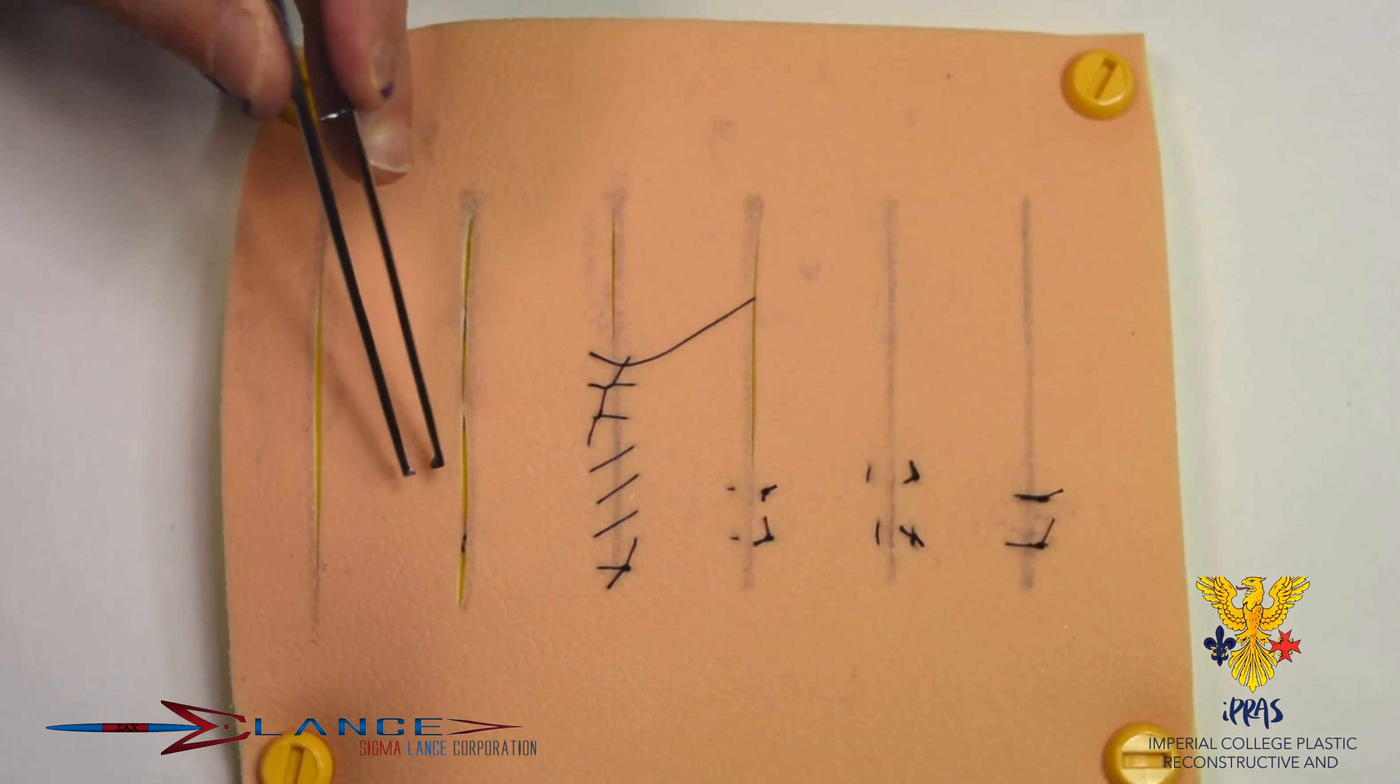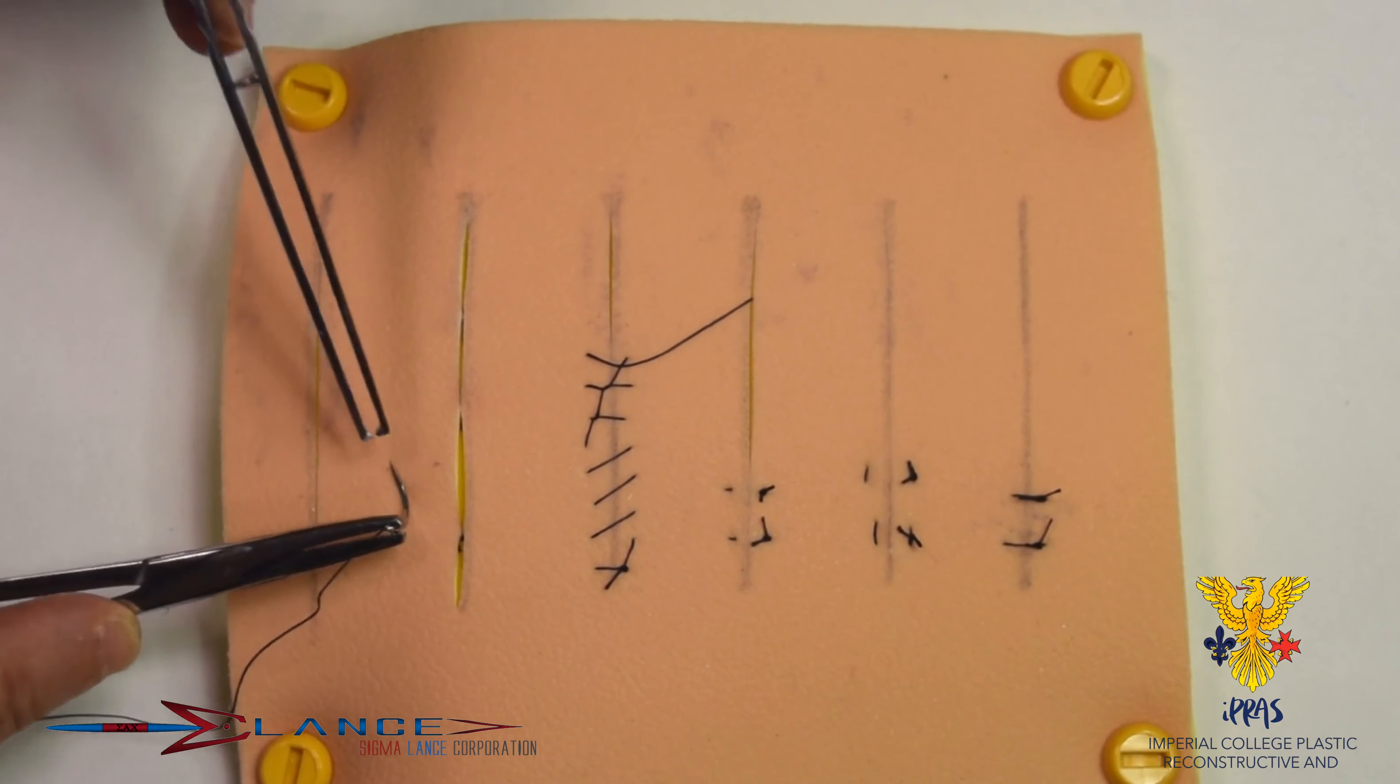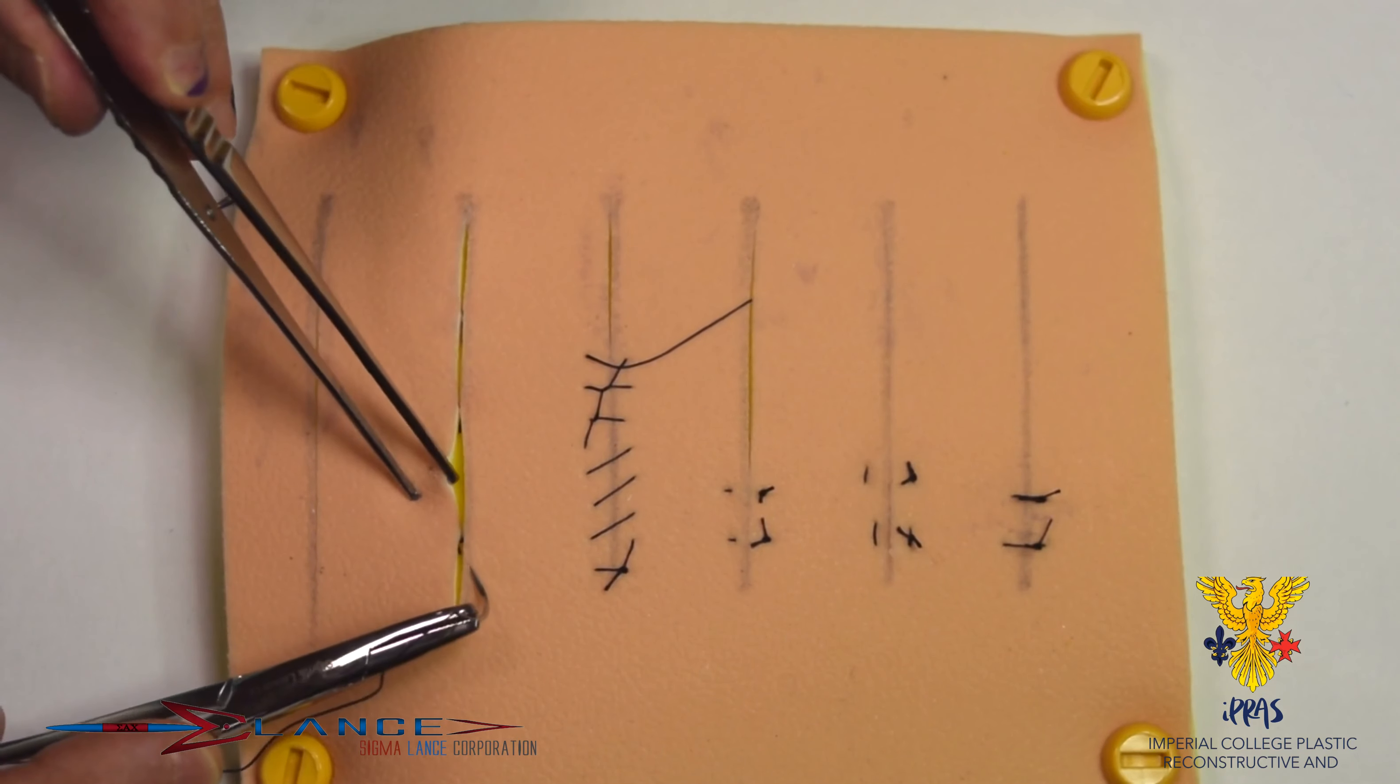Okay, so the next suture we're going to demonstrate is the subcuticular suture, which is the commonest way plastic surgeons close the wound. And this shows a typical example of what would happen ordinarily in a normal wound.